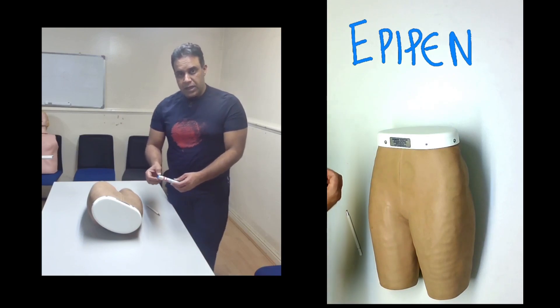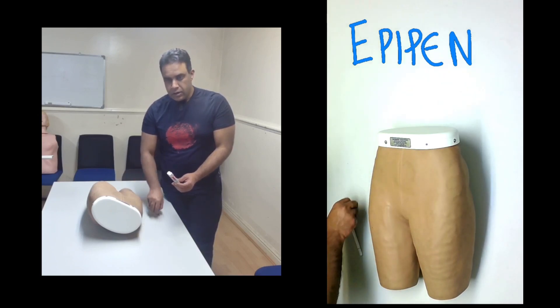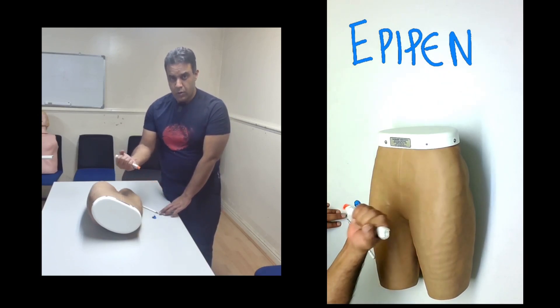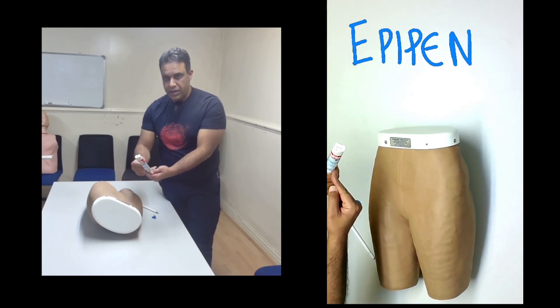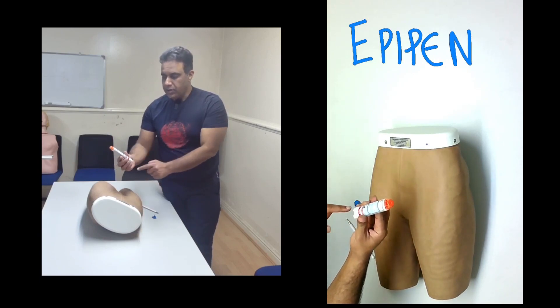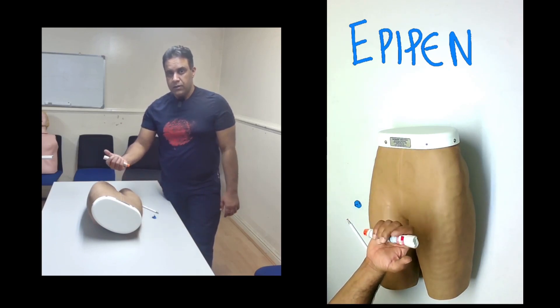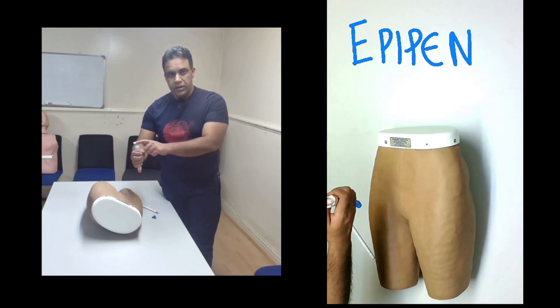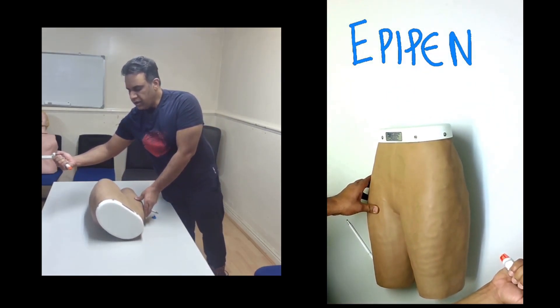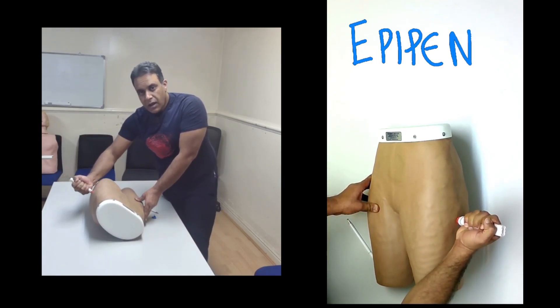Before you give it, take the blue top out — if it is still in place, it will not work. Then hold the EpiPen firmly, making sure you can read the English clearly. If you cannot read it, it means you are holding it incorrectly. Hold it firmly in your fist; you do not need to press anything separately. Bring it to the side of the thigh and press it against the thigh until you hear the click. After the click, keep it there for at least three seconds, then remove it.